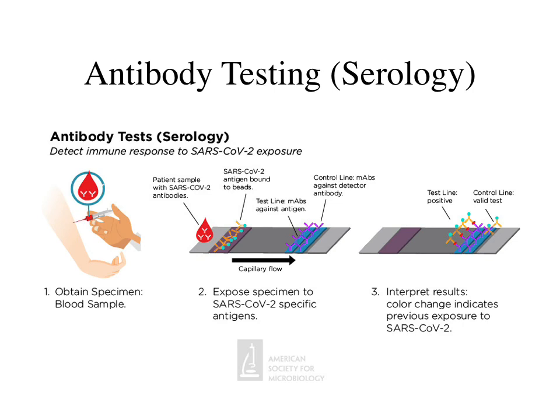The immune system naturally produces proteins called antibodies in response to infection. Antibodies recognize and bind to foreign molecules called antigens on the surface of pathogens. When an antibody binds to antigen, it seeks to disable the associated pathogen through direct or indirect mechanisms. Blood samples are used as the specimen type for antibody testing. COVID-19 specific antigens are mixed with the patient's blood, and if antibodies to the virus are present in the blood, the two will bind to one another, resulting in a color change that marks the test positive.